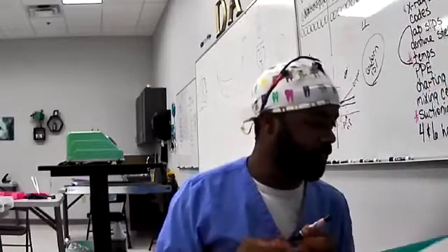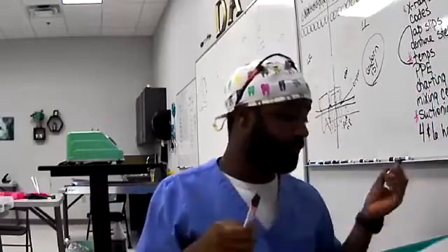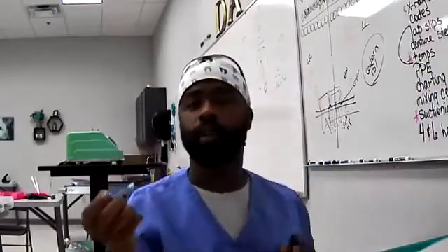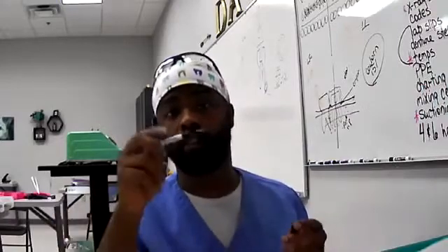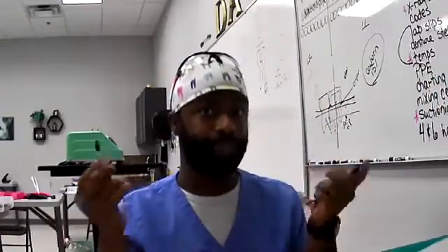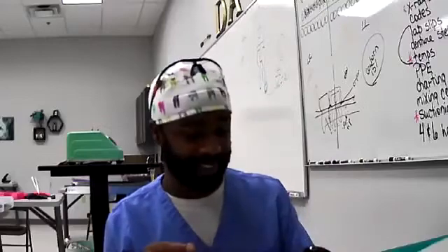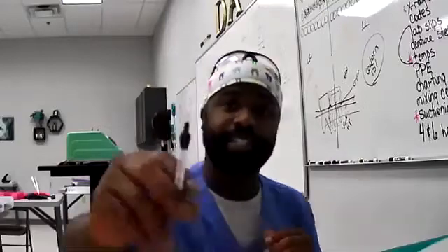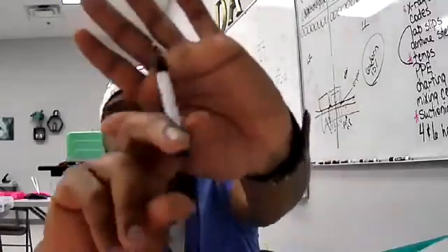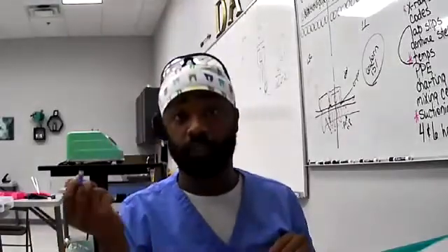okay. So we have two different materials in here. We have a flowable material, which is called flowable only because of the viscosity, which means it flows out easier. That's going to be the easiest way to remember that. It has a tip on it, kind of like a syringe or a needle, but it's flowable because it flows out easier.